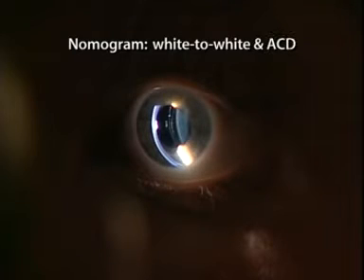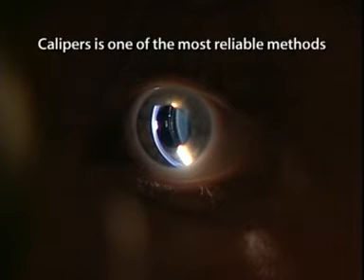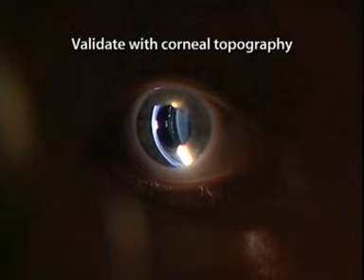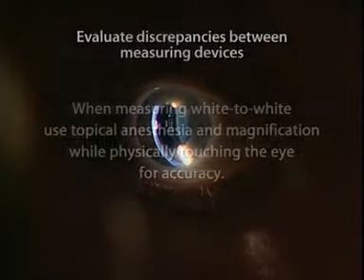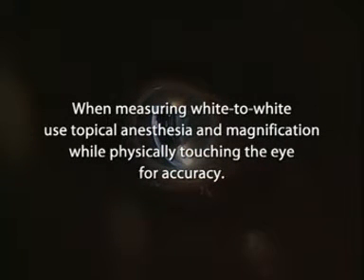The measurement of white to white is critical. Physical measurement with calipers is one of the most reliable methods for obtaining the measurement. Validate the measurement with a corneal topography unit, such as Orbscan. Evaluate any discrepancies between measuring devices. Sometimes a pterygium or other anomaly can cause a discrepancy, as can improperly calibrated calipers. When measuring white to white, use topical anesthesia and magnification while physically touching the eye for accuracy. Remember, the ICL is not recommended with an ACD of less than 3 mm.